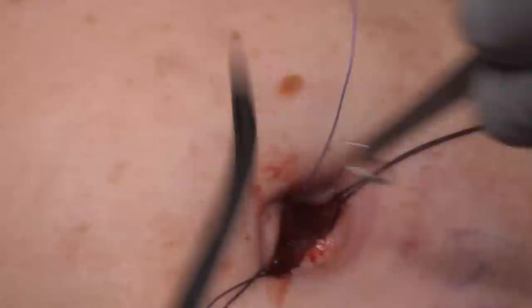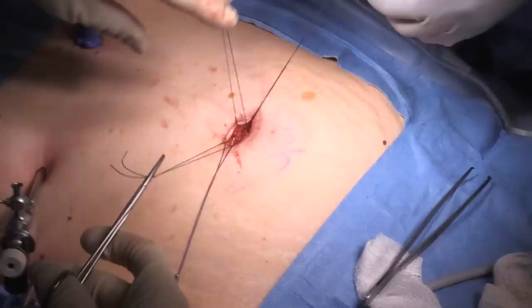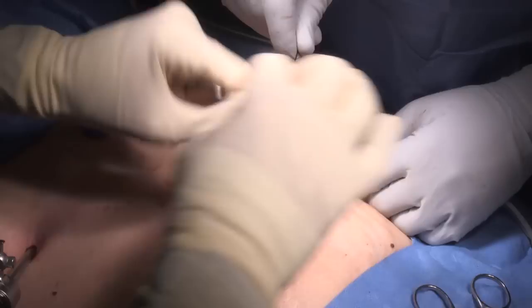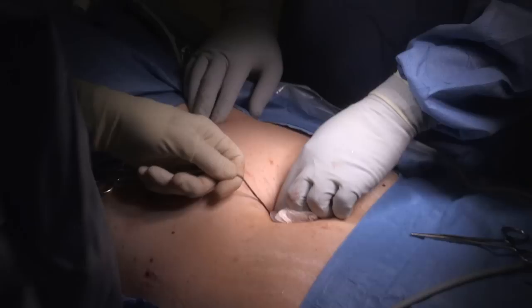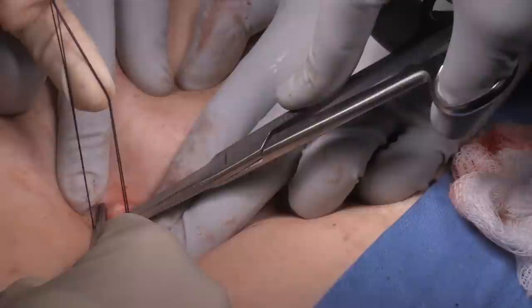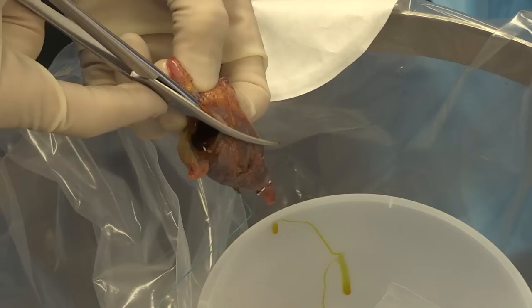The abdomen is evacuated of CO2 and all ports are removed, and then the remaining opening in the umbilical fascia is closed with a couple of interrupted Vicryl sutures. If a small umbilical hernia is present, then we would use a non-absorbable suture for this part of the closure. The sutures are tied down, and then I like to elevate them and inject local anesthesia into the fascia and skin and subcutaneous tissue at the umbilicus, since that's the largest incision and where patients typically would have the most discomfort. Then the sutures are cut, and all the skin incisions are closed with an absorbable subcuticular layer and Steri-Strips.